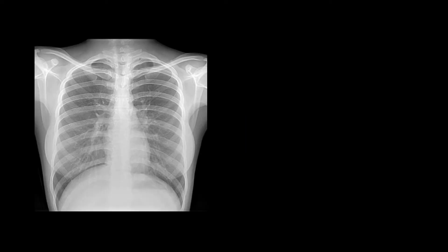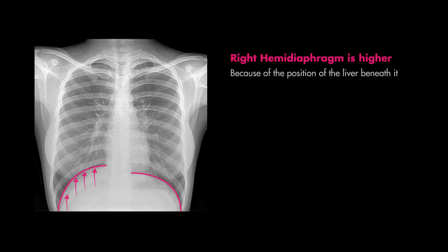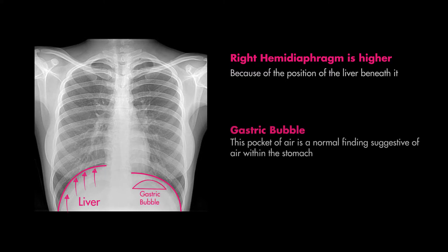When assessing the diaphragms you want to make note of their shape and position. Remember that the right hemidiaphragm is higher than the left due to the position of the liver underneath it. On the left side lies the stomach, and sometimes you'll be able to see an air bubble like you do here. This is a gastric bubble representing air in the stomach, or sometimes even the colon depending on its position within the peritoneum.